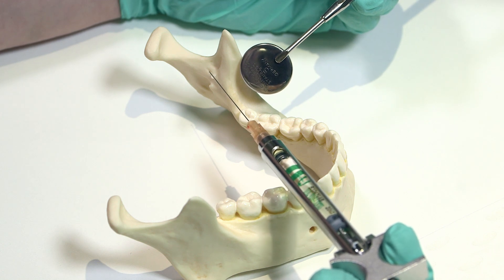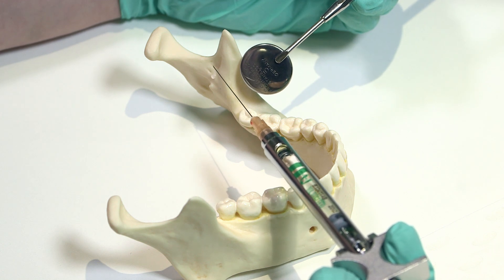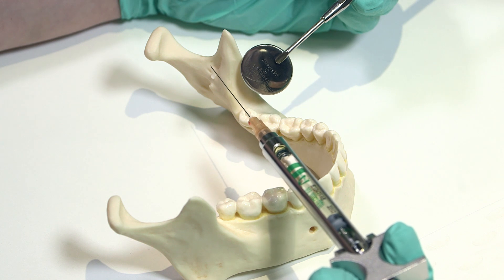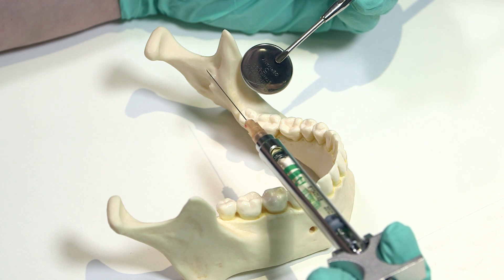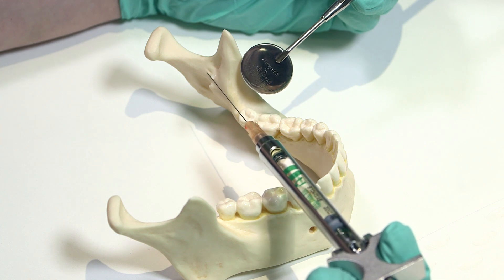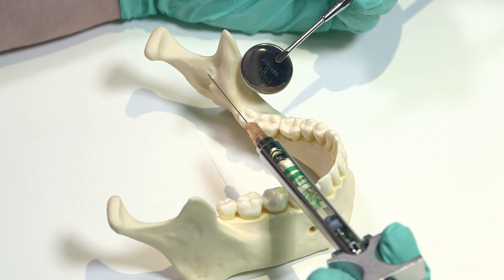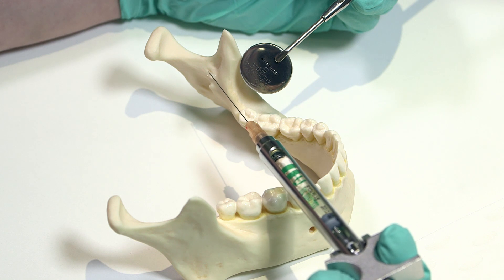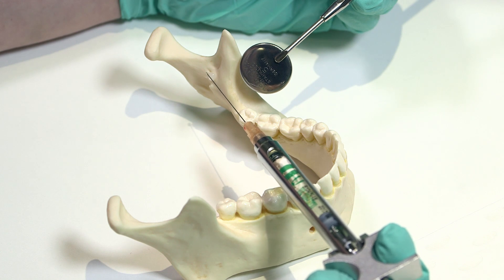Then we're going to aspirate, gently pulling back on the ring to ensure that we haven't pierced the blood supply, and then we will deposit the solution slowly.